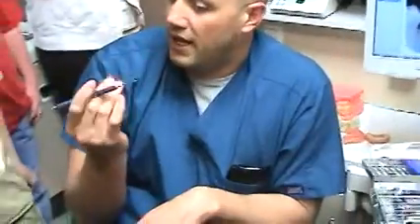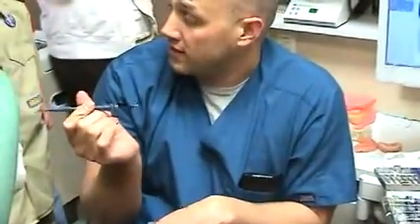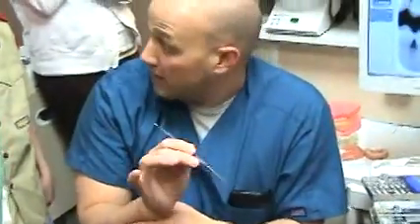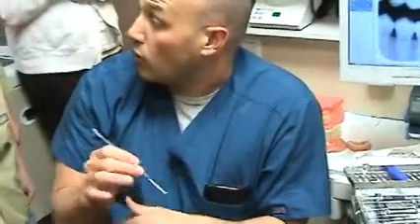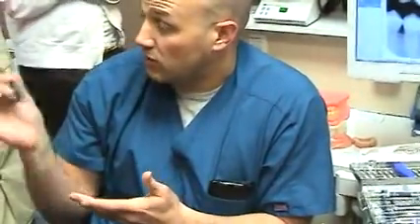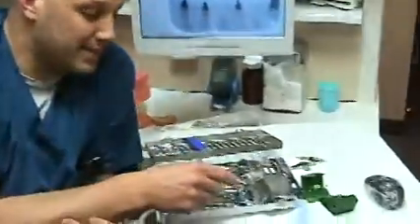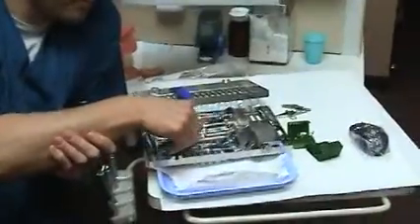This instrument is very handy when restoring a composite, because it's a composite resin, and we can gently push that down into the cavity. When we did the silver restorations, we had to pack them very firmly, and place a lot of pressure in somebody's mouth in order to make it dense.